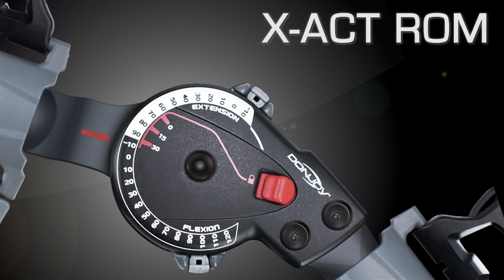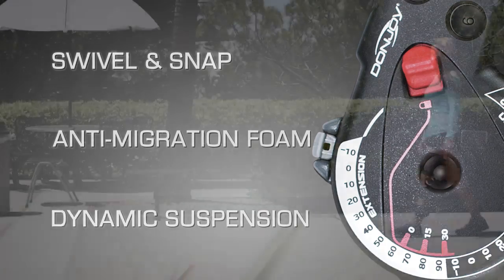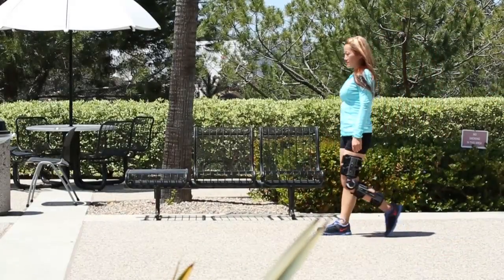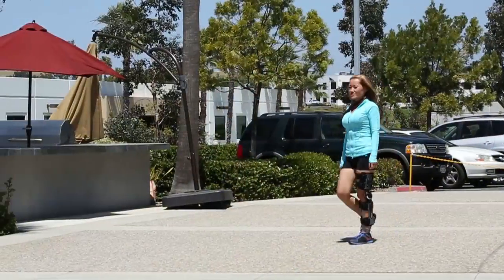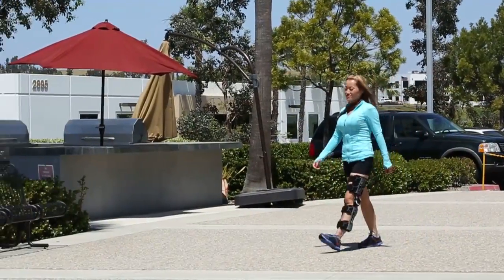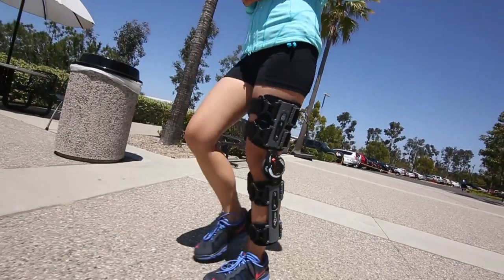DonJoy's Exact ROM knee brace with swivel and snap features, anti-migration foam, and dynamic suspension frame provides post-op patients with a lightweight, comfortably fitting brace. The Exact ROM is designed for quick and easy application and is an excellent solution for patients who want a stable, secure, and durable knee brace.